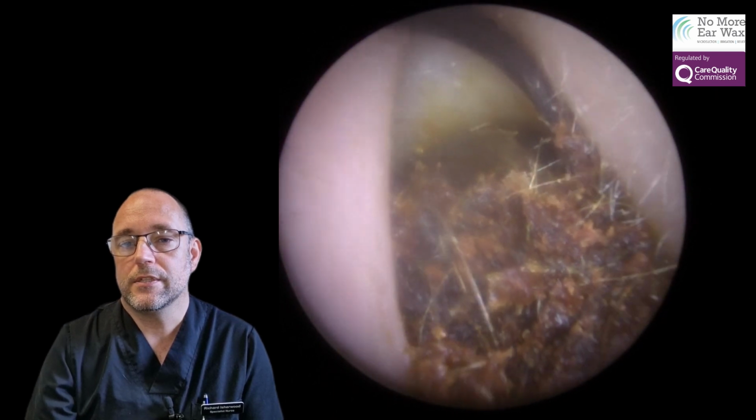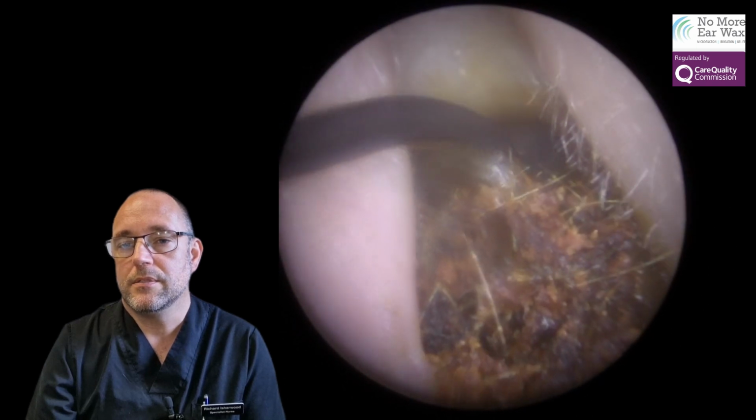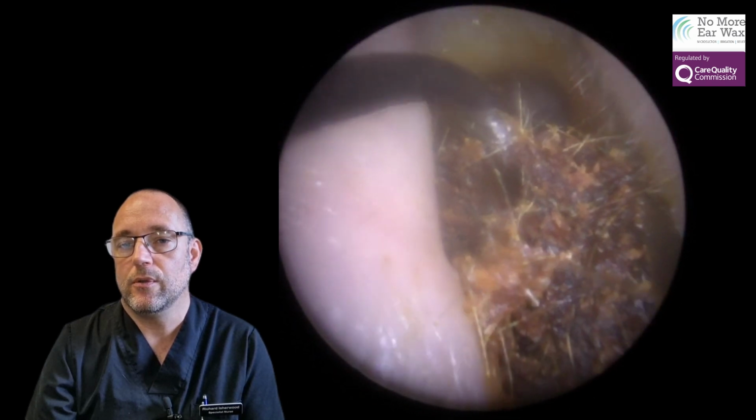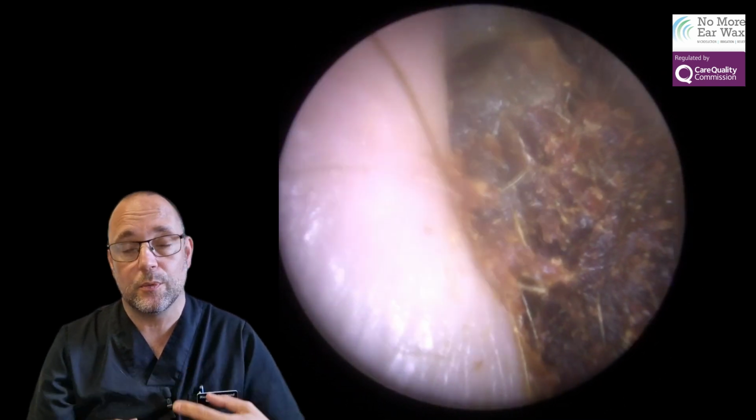So we're going to go for that same spot again. Hopefully get a little further back. Dig it in and literally roll it forward. Trying to do it really slowly because again, you don't want it to slice through, but you still do want it to pull it forward.